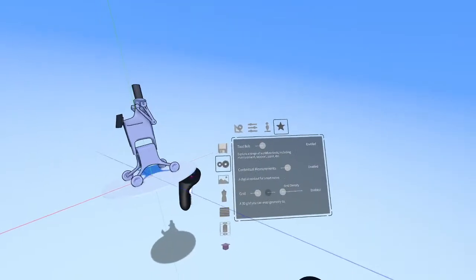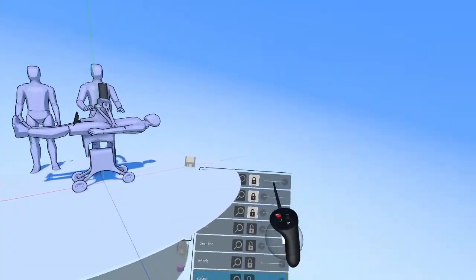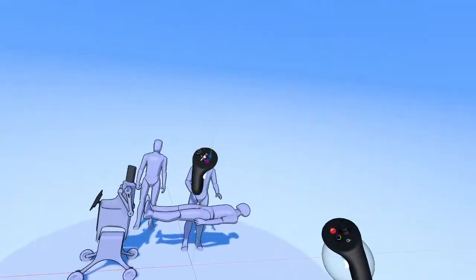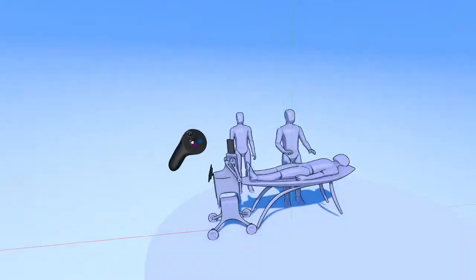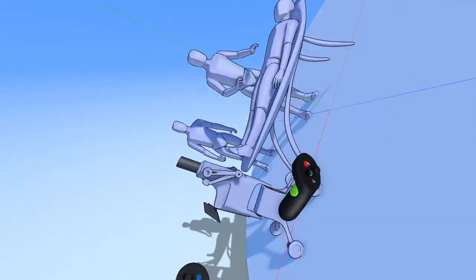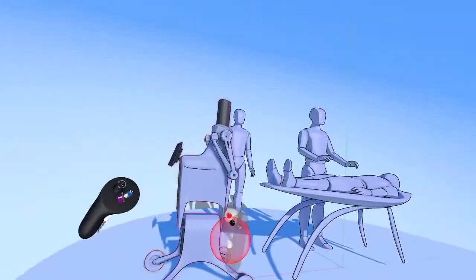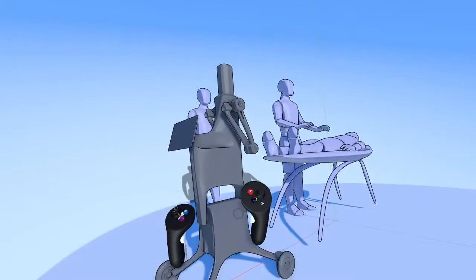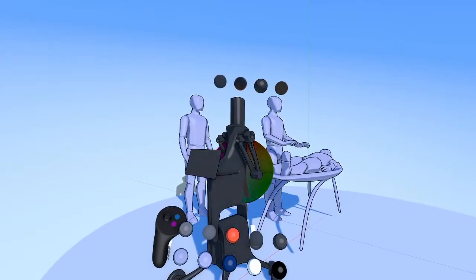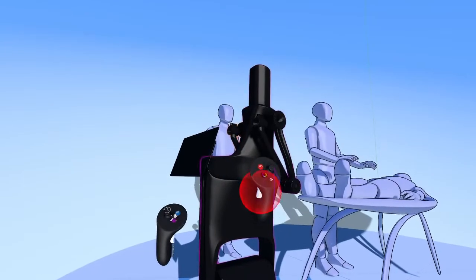Cool, and let's see this in the setting with everything else. So turn our people on here. Whoa, okay, so the robot is just going through his body. All right, let's shift that back a bit. Turn on the people, turn on the table that we built here, and I'm actually going to group together this entire robot like this. Make sure I got all the pieces there. And let's go very dark on it, and then ungroup it.